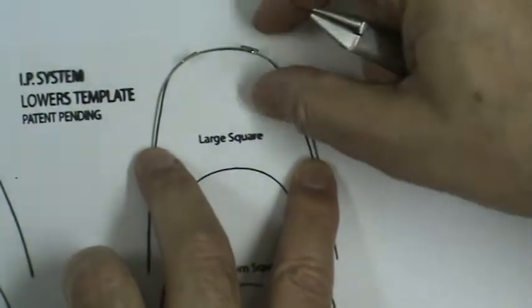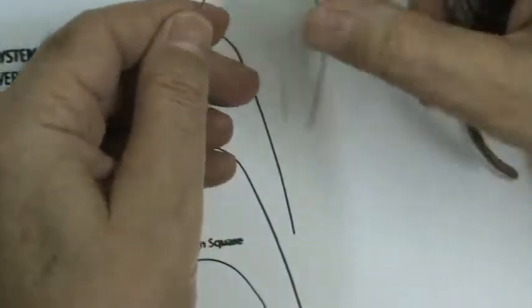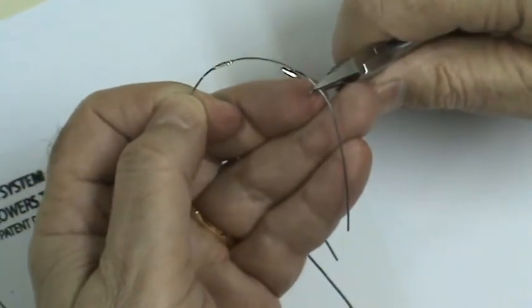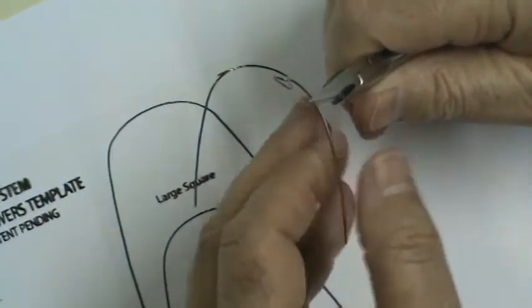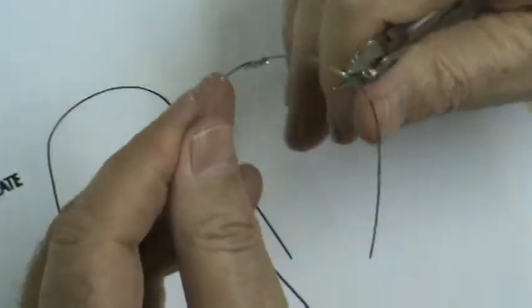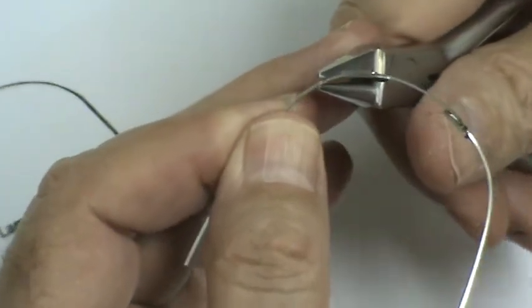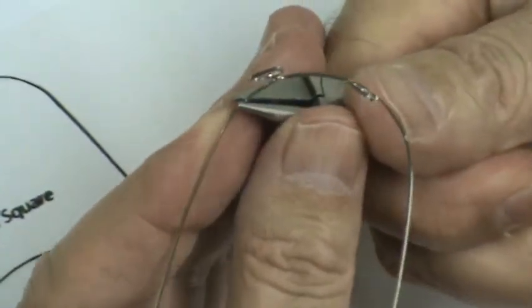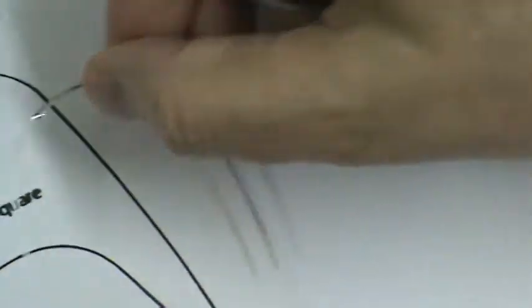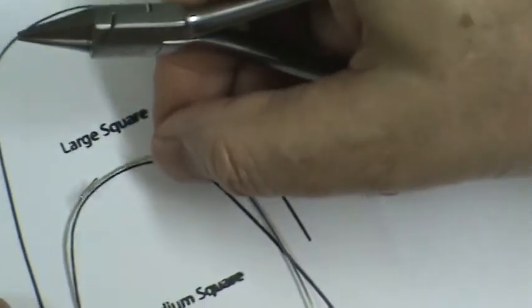So let me take a light wire plier. I'll put it on the mark, the round end on the inside. I'm going to bend it in just a little bit. Put it on the other side, bend it in the same amount. You just hold the wire with the plier, bend it in with your finger, and then compare.